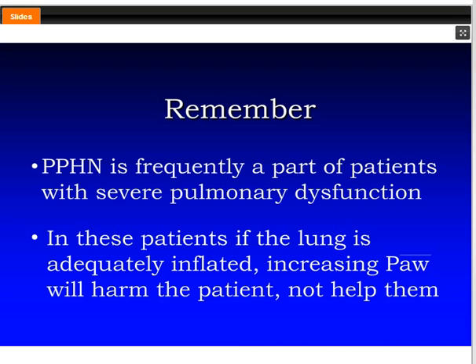You talked about changing frequencies. What about IE ratio? Yeah, I think that's a good question. We have always used an IE ratio of basically an I time of 33%. The reason was some of the early studies that were done with high-frequency ventilators that had a 1-to-1 IE ratio, one of their problems was air trapping with patients. And we recognized that, and that was one of the positive things about the 3100 ventilator, you could alter inspiratory time.